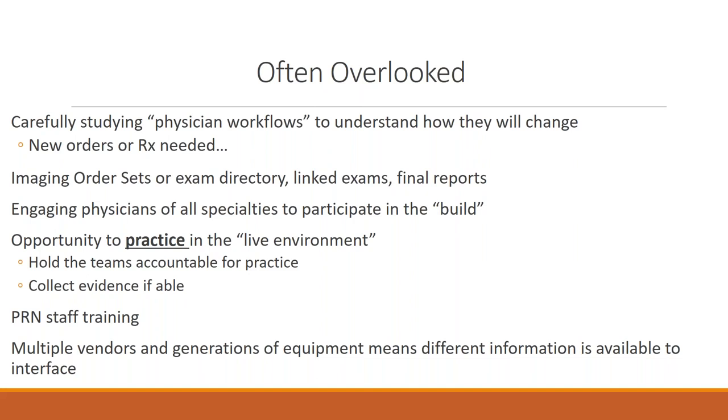Engage physicians of all specialties to participate in the build. Anybody that's going to receive or be part of imaging, make sure that they have some input, and an opportunity to practice in the live environment.